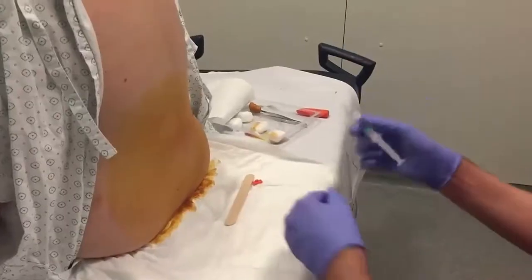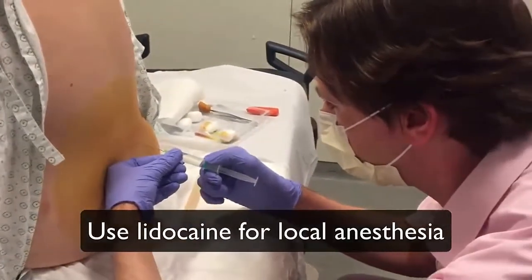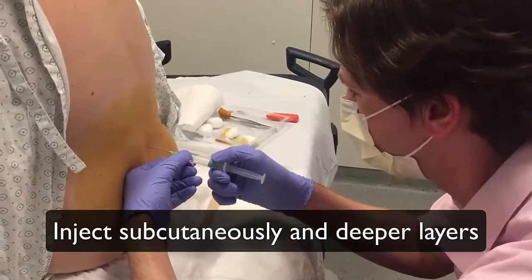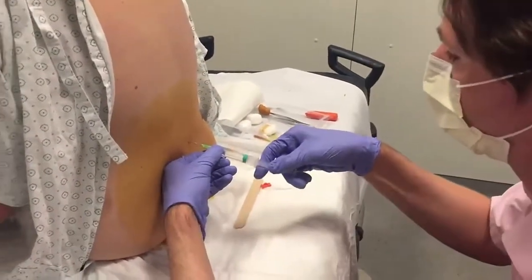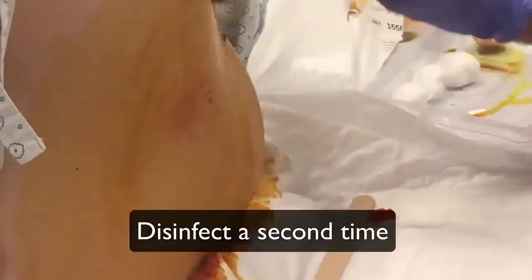Use lidocaine 1 or 2% for local anesthesia. Inject lidocaine first subcutaneously, then infiltrate the deep layers. You might want to disinfect the skin a second time.